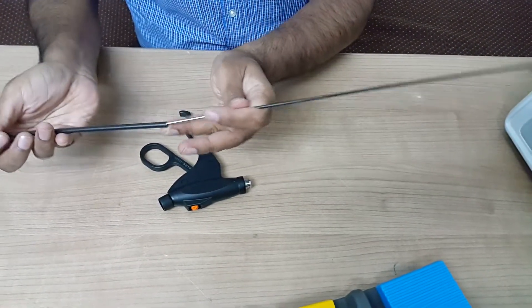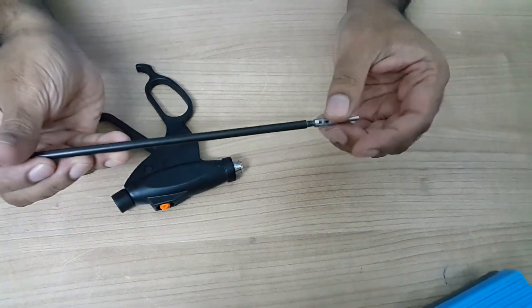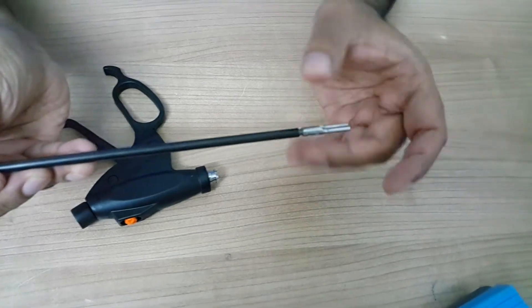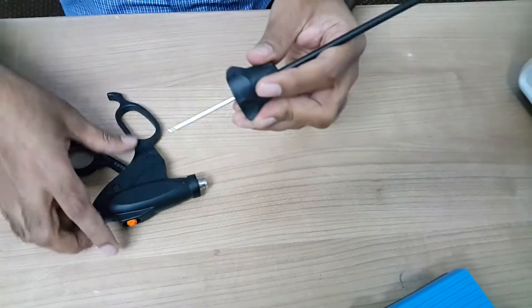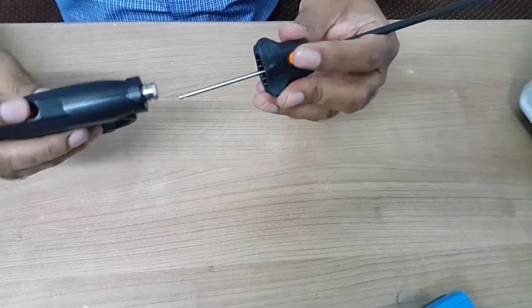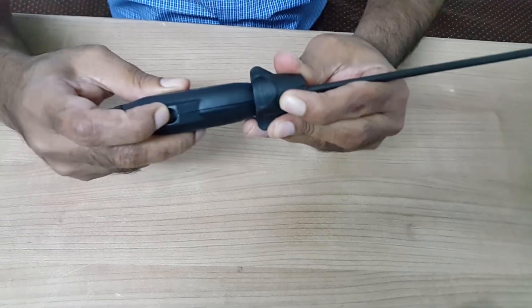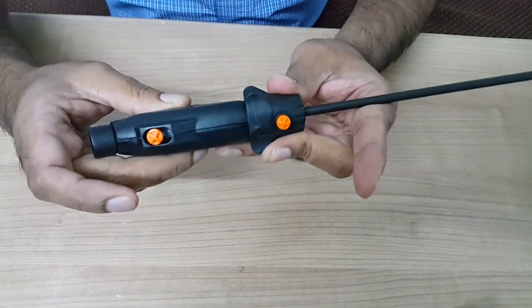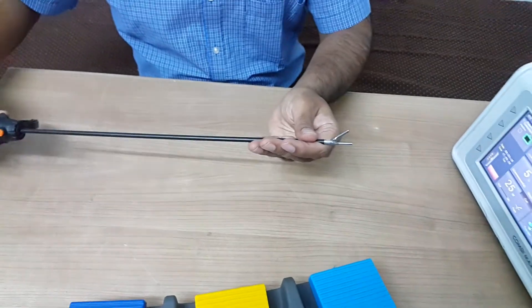Just insert this into the shaft and lock. Now match these orange buttons in line. Press these two buttons and insert. Now you can hear a click sound. Your instrument is ready to use.